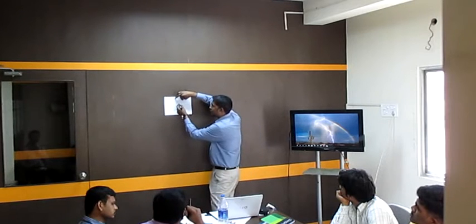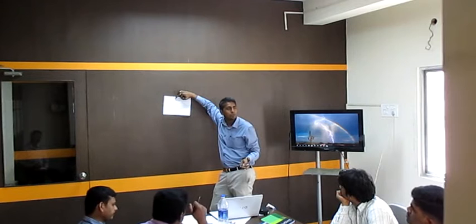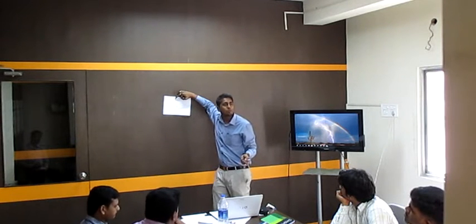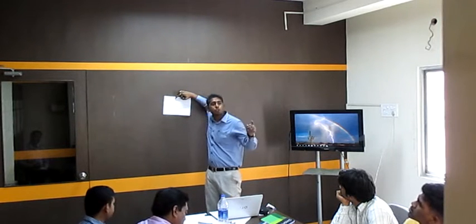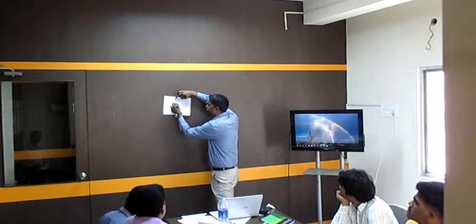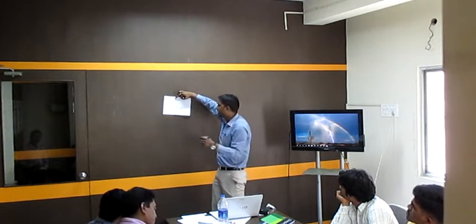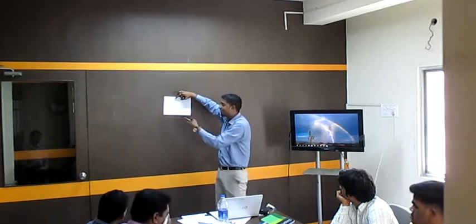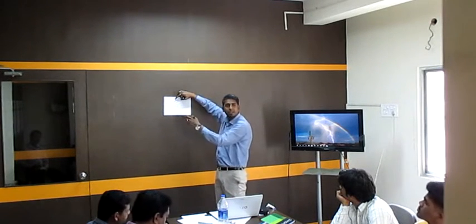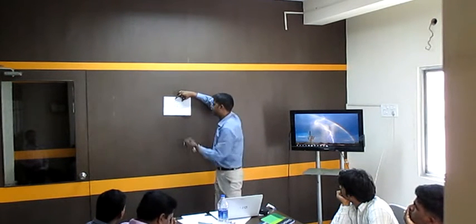Why? Because torque is ultimately what? Force, angular force, right? So if you increase the force, you will increase the pressure. But if you increase the area, you will decrease the pressure, because it is in inverse relation. Getting my point or not? Should I repeat it? Okay.